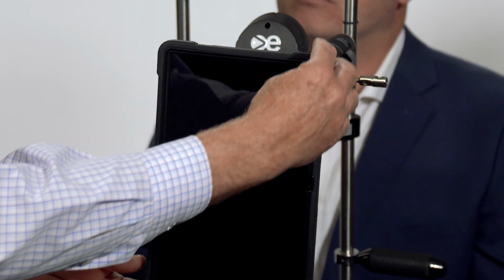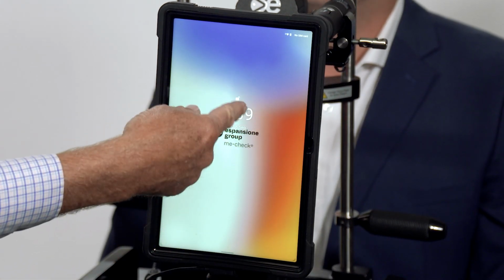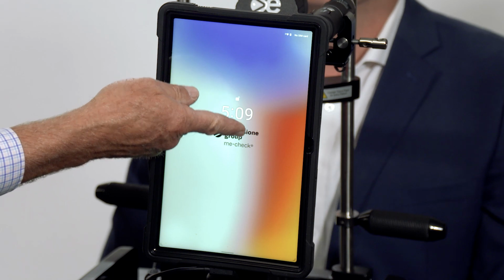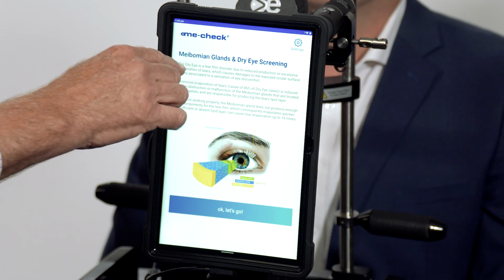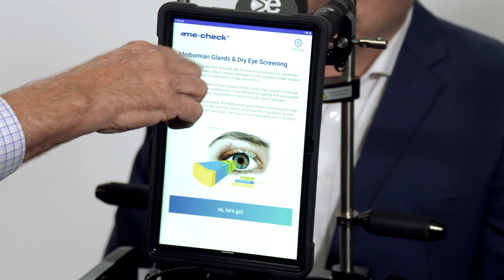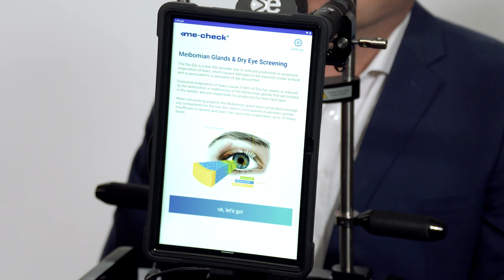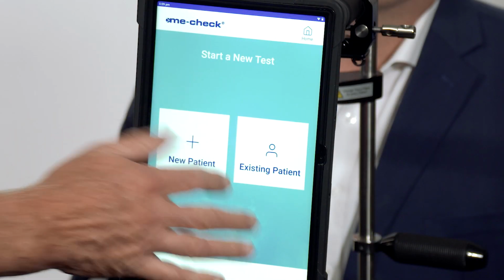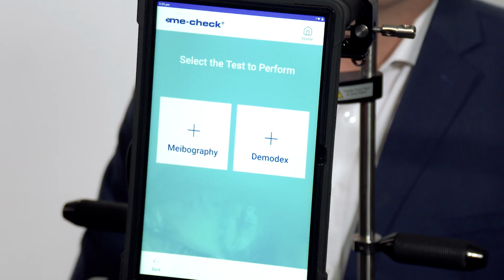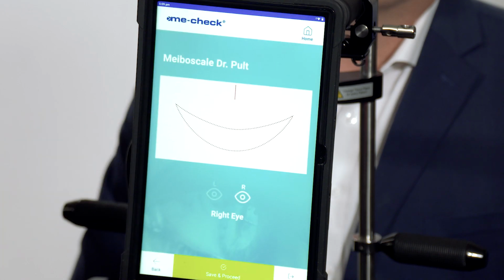To establish contact on the tablet, just push the button up on the top. It'll say Espansioni group. For us to get to our working page, you want to swipe up. When you swipe up, it will tell you what Meibomian glands and dry eye screening is all about. This is verbiage as to what we tell patients is going on during this procedure. If we have an existing patient, we'll tap existing patient. If the patient's coming in new today, we're going to hit new patient. What we're going to be doing right now is talking about meibography.